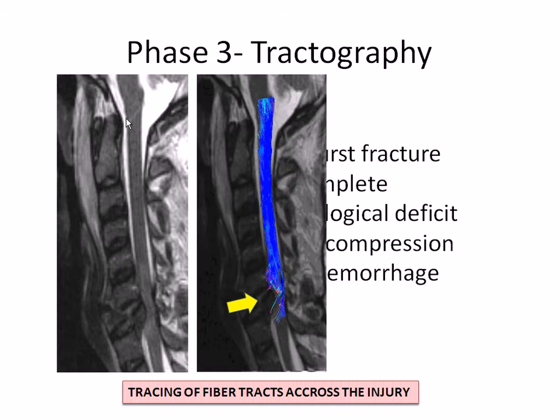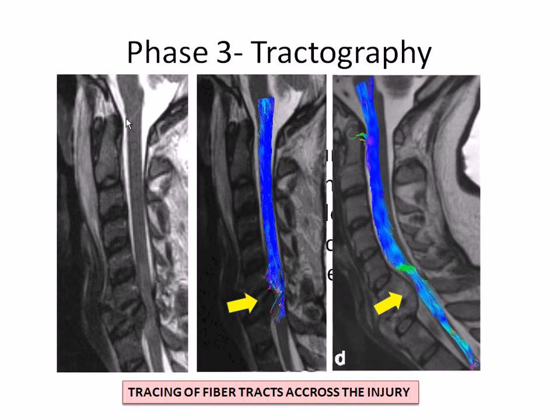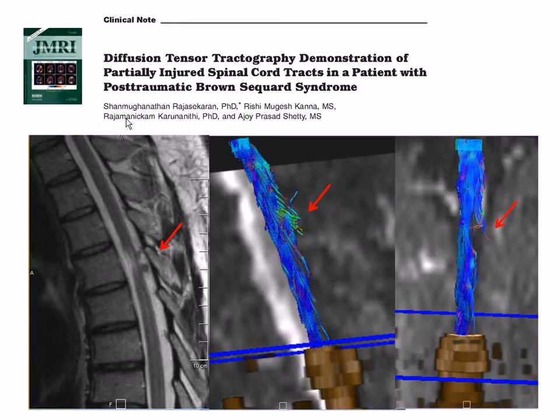And if you put a seed point below, you can see a continuation, then you know that these patients will completely recover. Now we have found this, and we are documenting it in about 30 patients being followed over a period of 2 years. So on day one itself, it may be possible for us to get a good prognostic imaging.